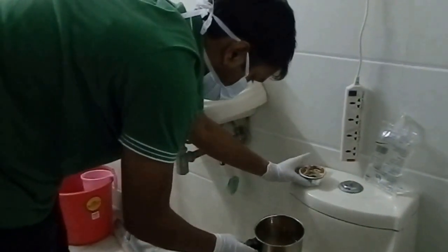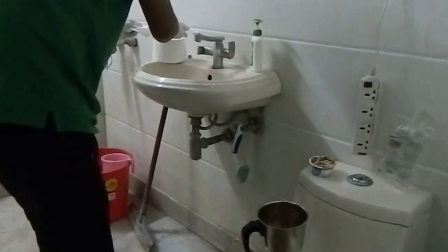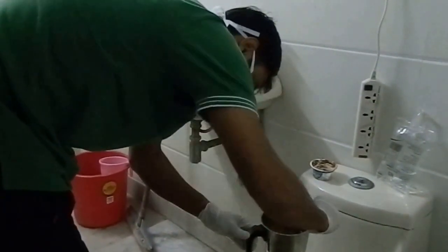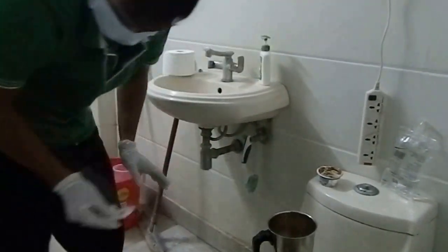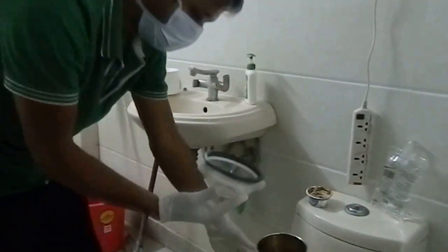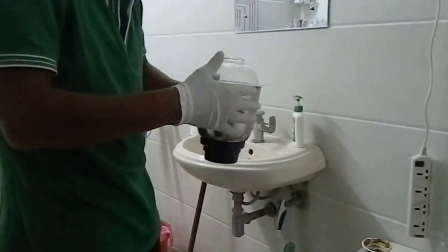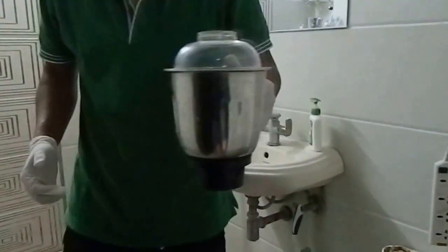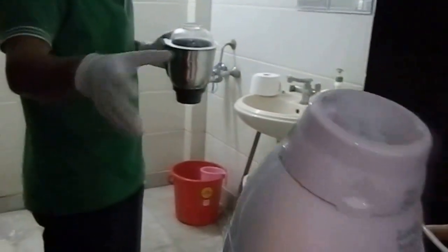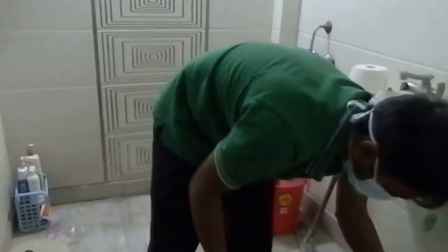So we have put approximately 250 milliliters of water. You would have seen the pictures — all of these utensils have been washed with saline water to get rid of anything that's not required. Now the jar is set.